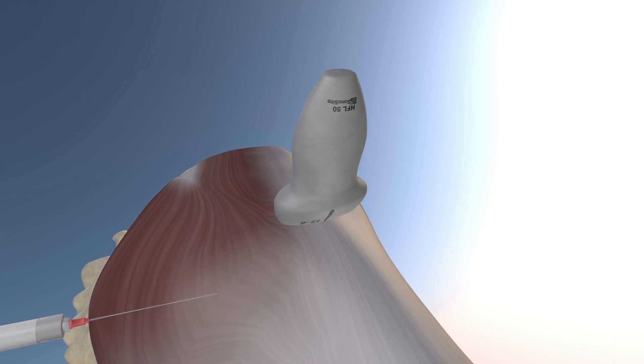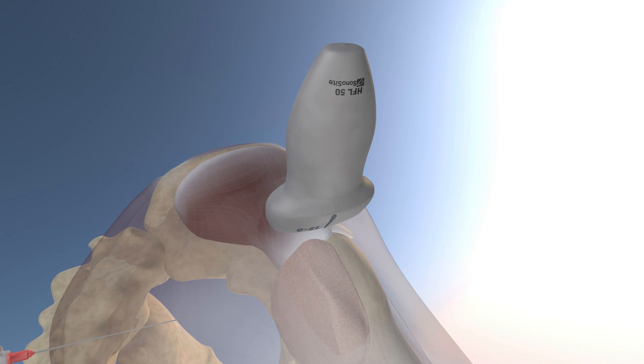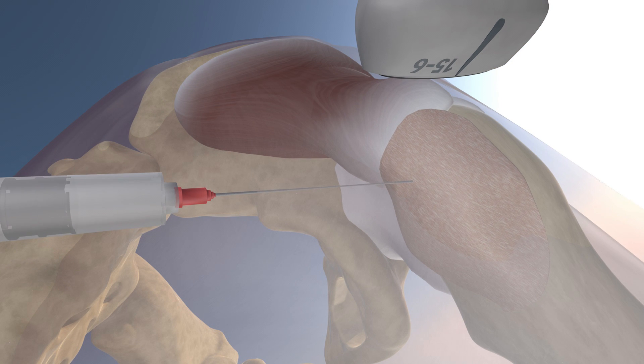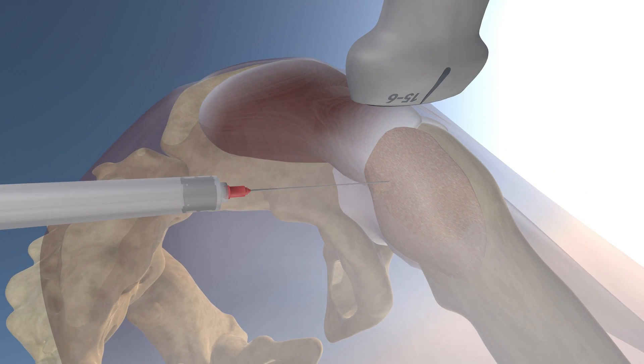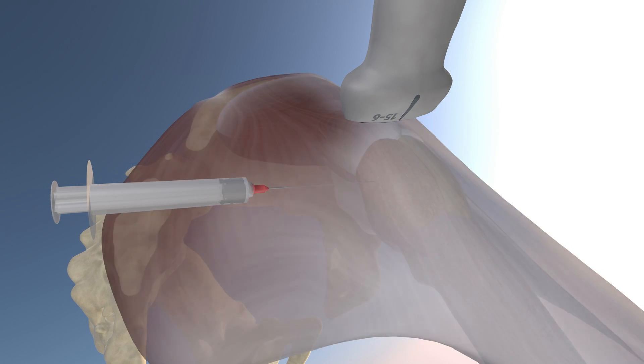We're going to go over a 3D model of this procedure, draining this very large greater trochanteric bursitis. Here we're making the gluteus maximus muscle and the iliotibial band translucent, and the needle is draining this very large greater trochanteric bursa, and now we're injecting cortisone into the bursa. You can also appreciate the gluteus medius tendon underneath this bursa, and here we're making the gluteus maximus and iliotibial band opaque again.